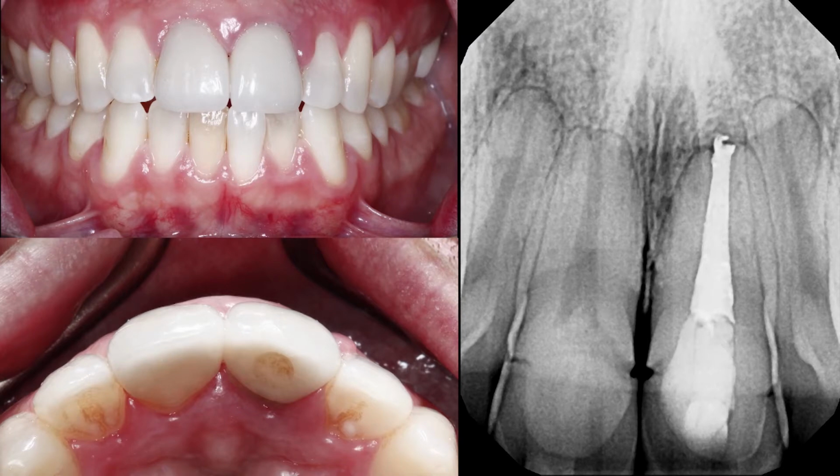And as you can appreciate in the clinical situation, these teeth are quite bulky. And on the radiograph, you can see that there are some open margins. So the crowns initially did not fit quite that well to begin with. So my concern was, once I remove these crowns, to evaluate what's underneath. And obviously tooth number 9 has an existing root canal.